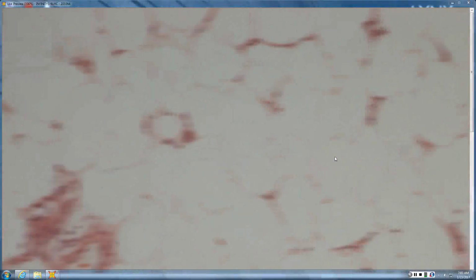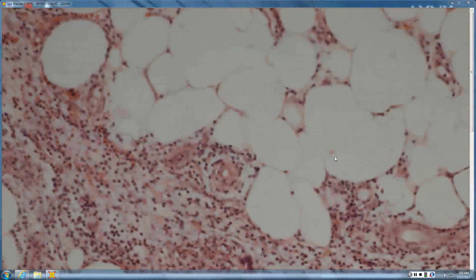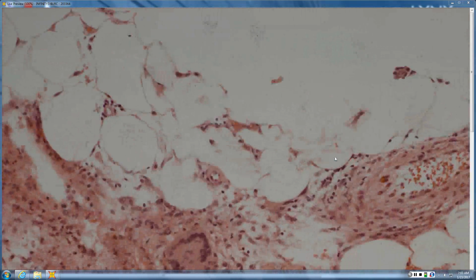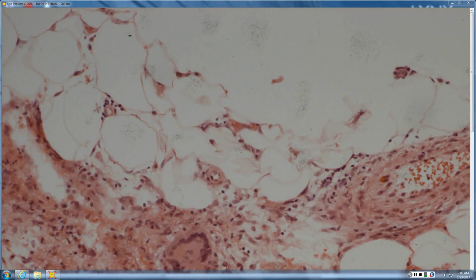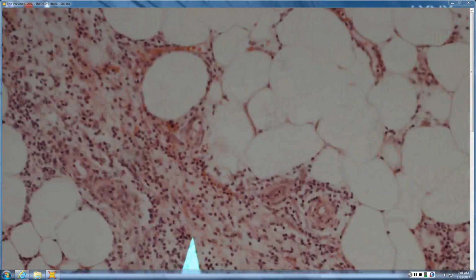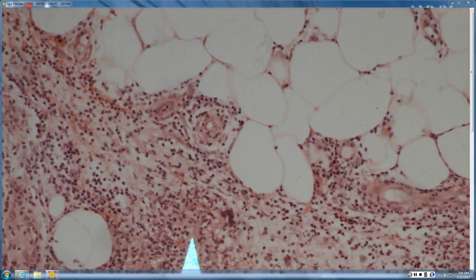And then if we go down here, there's some granulomatous infiltrate as well. This is a foreign body type giant cell, and here's another one. So in erythema nodosum, which is what this is, if you see little clefts with the foreign body giant cells, little granulomas radiating around them within the septum, those are called Miescher's radial granulomas, or microgranulomas, and they're a helpful clue to the diagnosis. These aren't really radiating around the cleft, but the fact that you have the little granulomatous component, I think, is helpful.